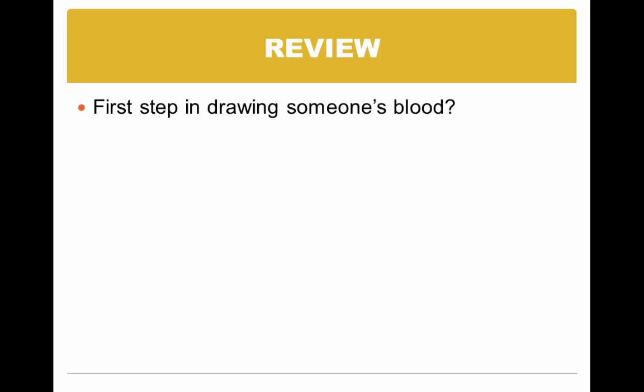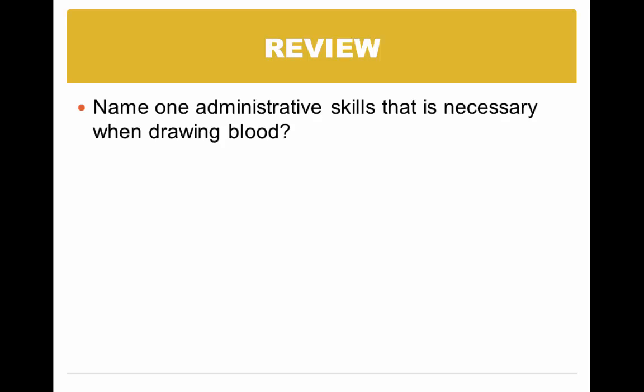The first step in drawing someone's blood, you want to put them at ease. I know you want your patient identifiers and you want to wash your hands because you're all good at that. But the first step when you're drawing someone's blood is to try to put them at ease. One administrative skill that's necessary when drawing blood, any of these: correctly labeling, correctly IDing on the primary container. You want to always attach a label or write on it the name of the patient immediately after drawing the blood, because we do not want any mistakes made and the wrong test results getting to the wrong patient, which can happen.